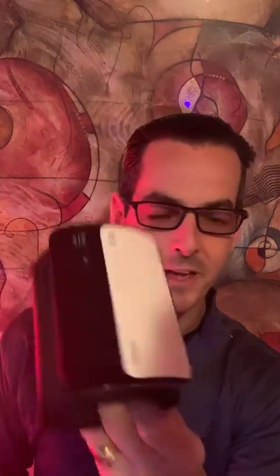Sometimes I get asked about other blood pressure cuffs. I don't rep for any particular ones. I'm not an affiliate for any of them, but I do tend to like the Omron brand. Omron as a whole makes good blood pressure cuffs, but they do have a nice portable one that has a transmitter that will record it on your phone, and you can keep a nice log of it. There's also a cloud service that you can upload all your information to, and then your doctor can log on and see your average blood pressures over time.